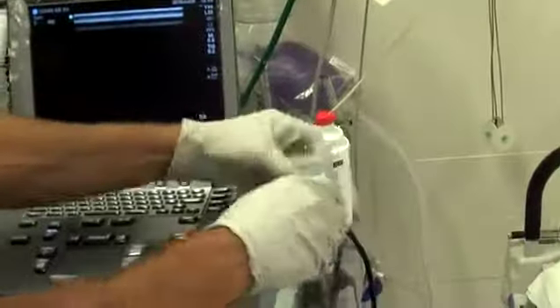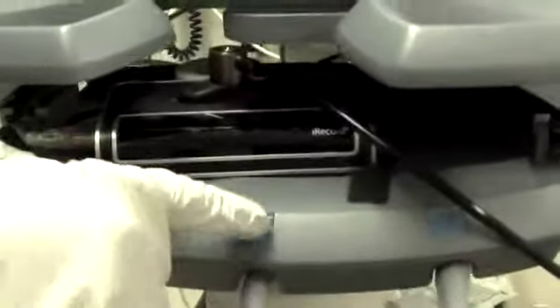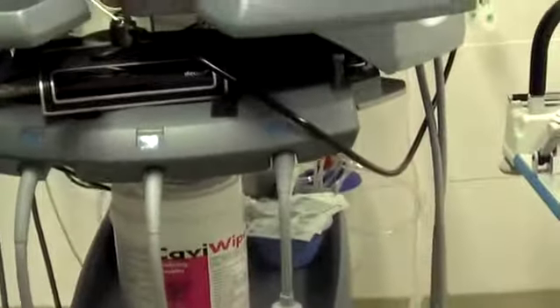How do we disconnect them? So yeah, you want to use a probe that's not currently connected to this three-way selector. And as an aside, in order to change which probe you're using, you just hit the button above the respective wire. Let's say, for example, that we would like to use the endocavitary probe, and it's not plugged in currently. So if you look underneath, there's a latch here that pulls down. Give it a turn, 90 degrees, and it'll detach.